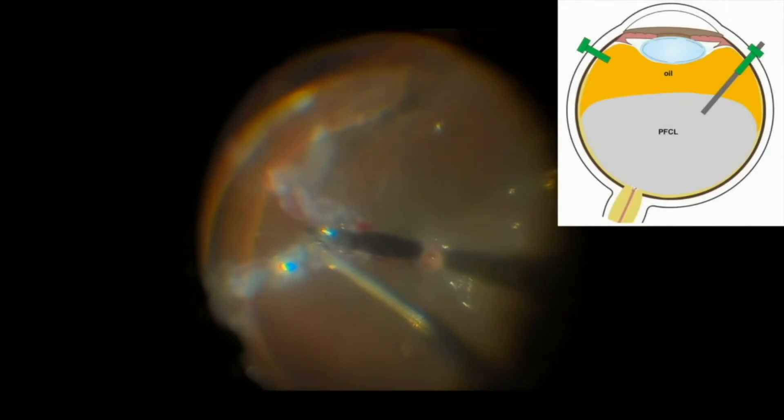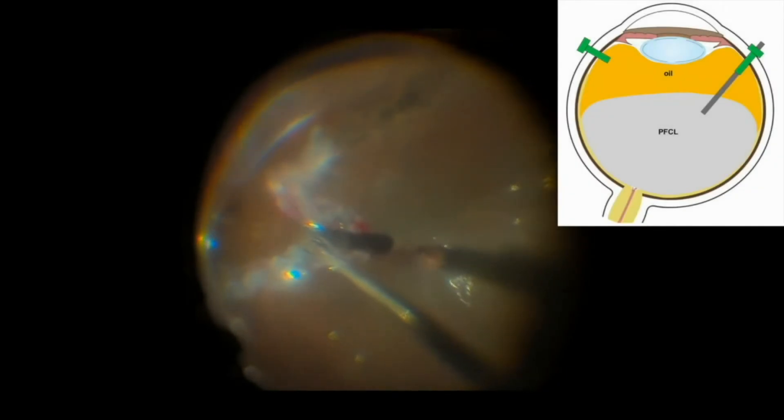After removing the BSS layer, PFCL is aspirated as the silicone oil is injected in the eye, as shown here, mainly at the edge of the retinal tear.